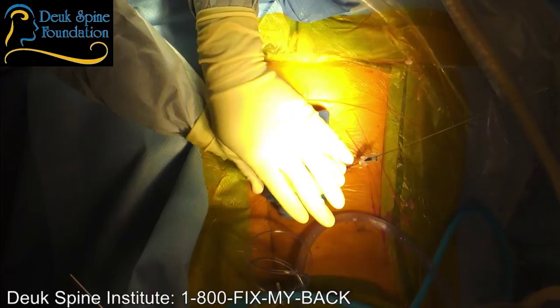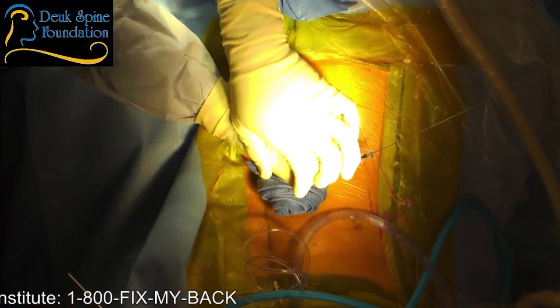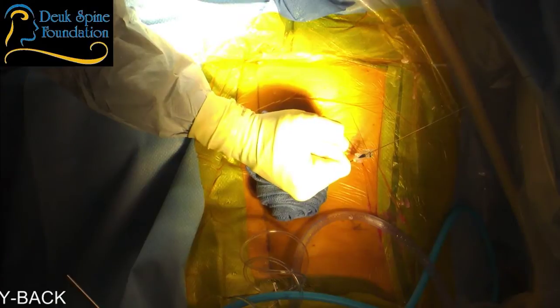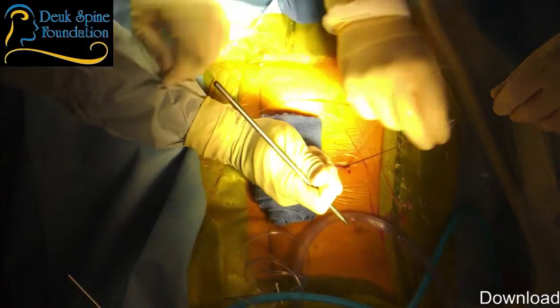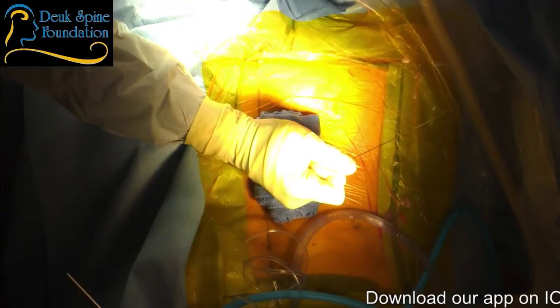All right, so we've got our last disc to do. You can see the needle and guide wire is still in there. And we're going to take the needle out under fluoroscopic supervision. And I'm going to leave the guide wire in. Remember, we only made one incision, one cut. One single cut to fix all 3 discs.